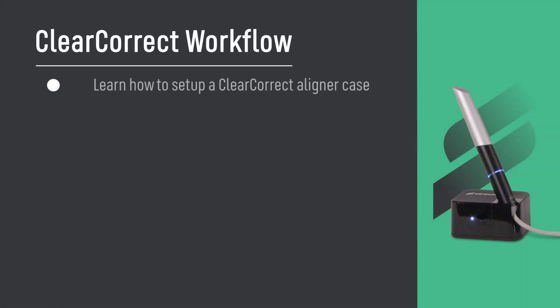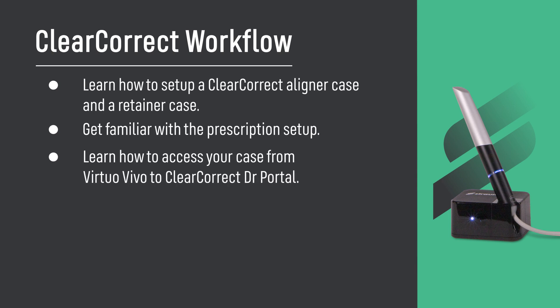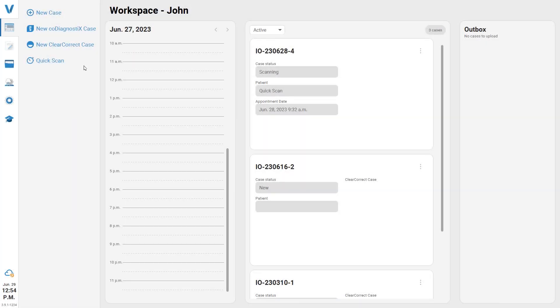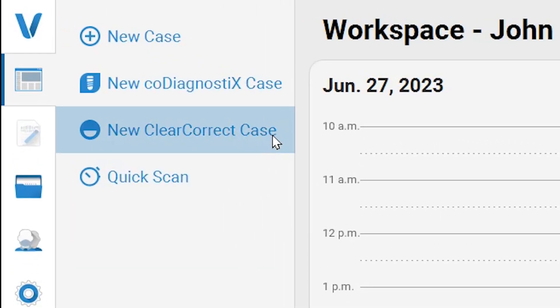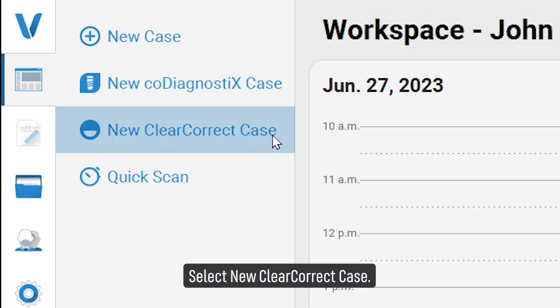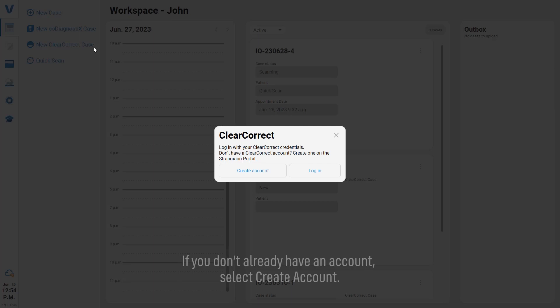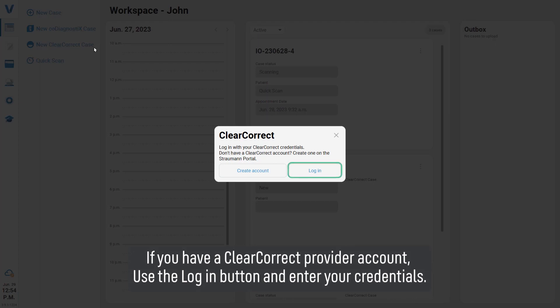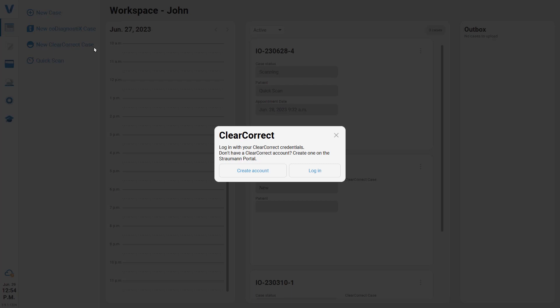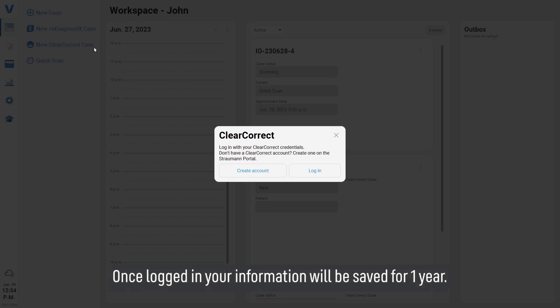Learn how to set up a ClearCorrect aligner case and a retainer case. Get familiar with the prescription setup and learn how to access your case from Virtual Vivo to ClearCorrect Doctor Portal. Select 'New ClearCorrect Case.' If you don't already have an account, select 'Create Account.' If you have a ClearCorrect provider account, use the login button and enter your credentials. Once logged in, your information will be saved for one year.